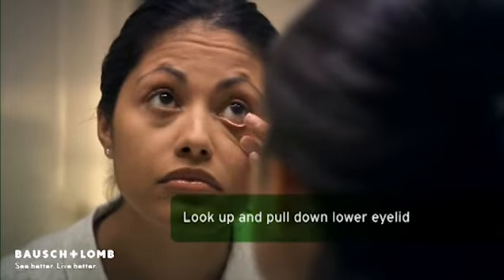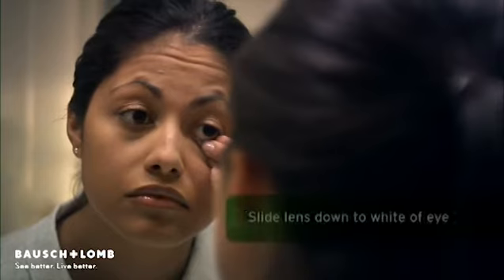Next, gently place your index finger on the lower edge of the lens and slide it down to the white part of your eye. Lightly squeeze the lens between the index finger and thumb. Remove the lens gently.